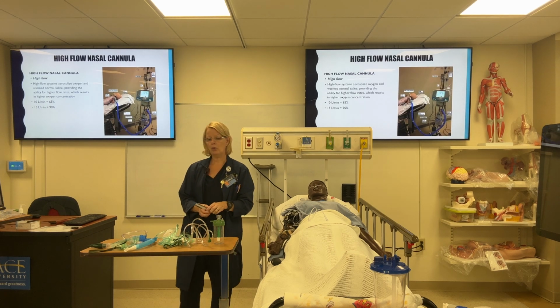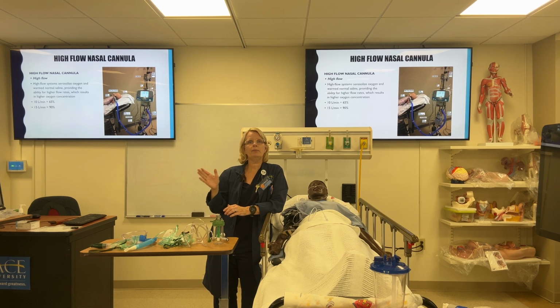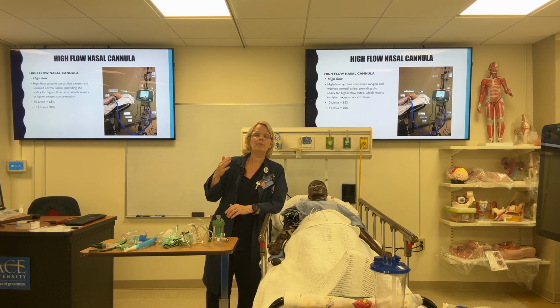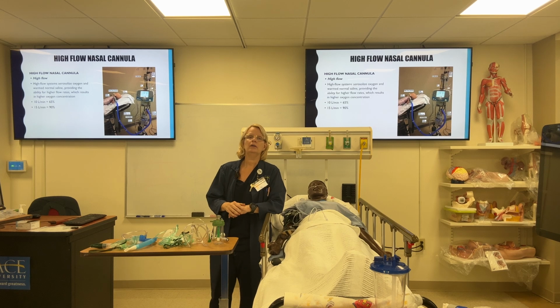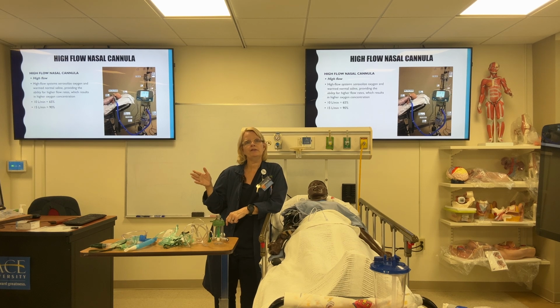If I want to use something called high flow nasal cannula, that is a high flow device. These devices were starting to be used before COVID, but they came in handy during COVID because those patients were so hypoxemic, and clinicians were trying to avoid intubating them because they weren't having a ventilation issue. They were having more of an oxygenation issue. So they were putting these patients on high flow nasal cannula if they could tolerate it.